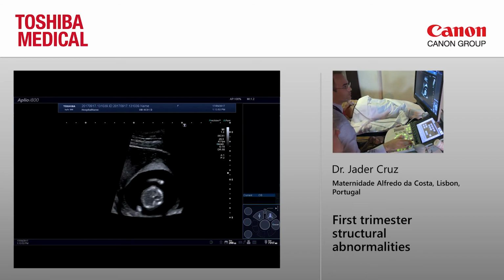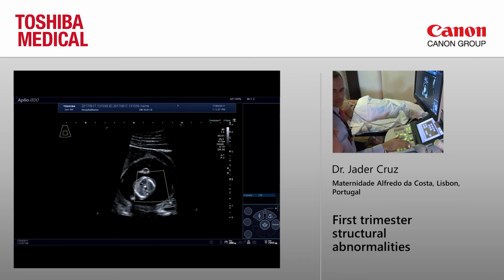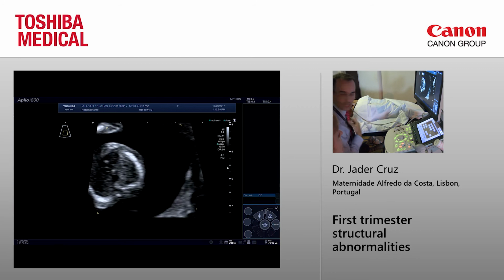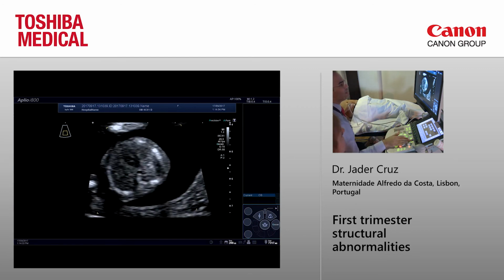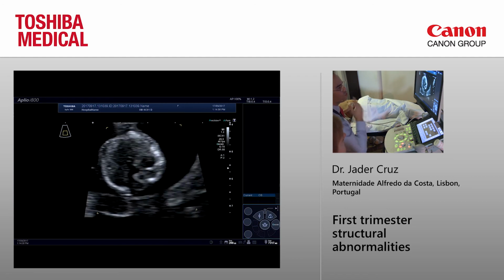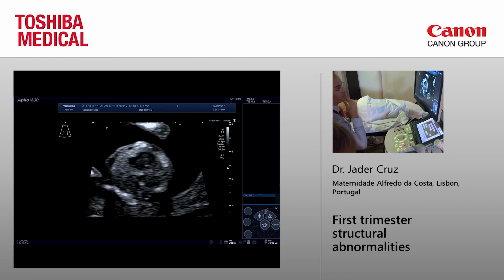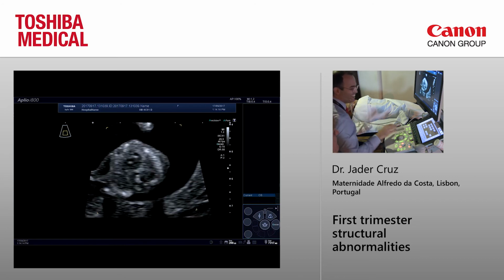Is it a different probe? Yeah, just changed. Well, the SMI works in every probe. Am I lying? No, you're not lying. I'm not lying. SMI works in every probe. I just like the presets of this probe more. And also, because, is that something I can say? I don't know yet.